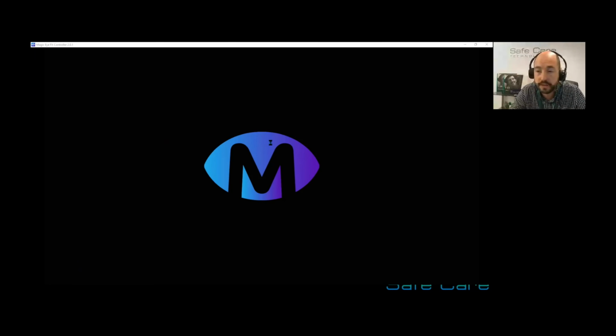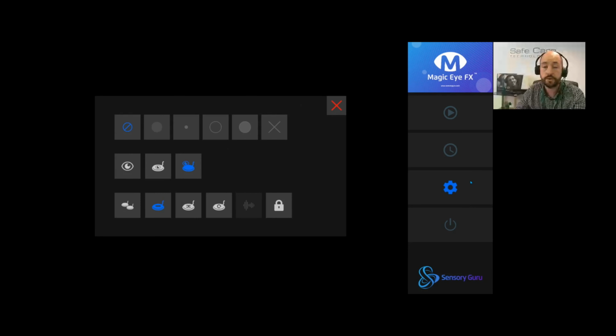So as I open up this particular activity, you'll see here now. Okay, so I press F8. And you'll see the menu has popped up on the right hand side. So this particular menu, as I scroll over each one here, we have power, which will turn it off. I have settings. I can go into settings and I can adjust the cursor. So for example, I could even say with my voice, cursor 2. Sometimes it doesn't recognize my voice.